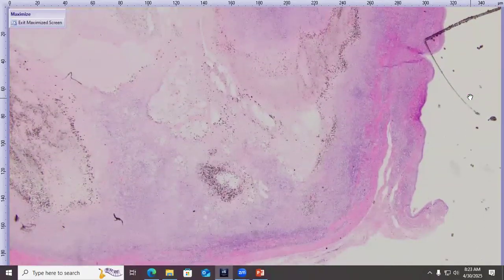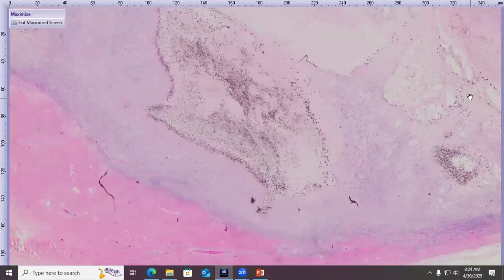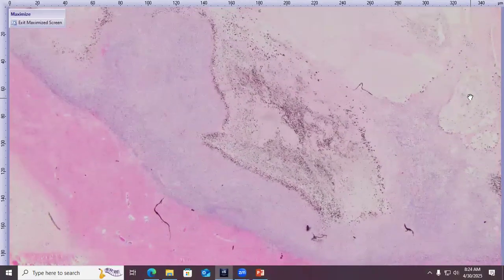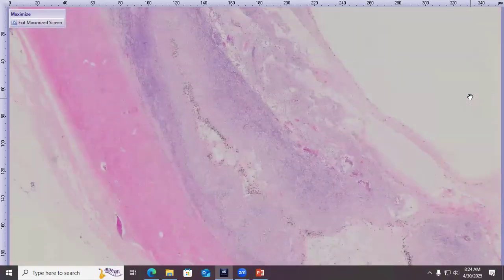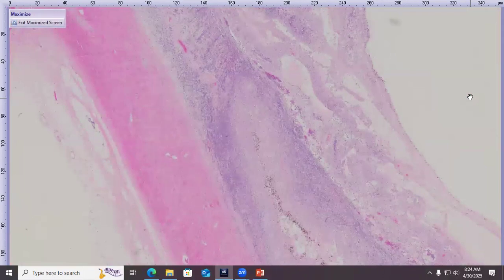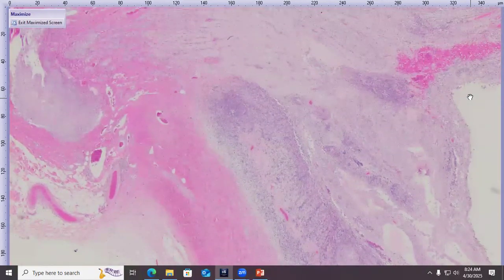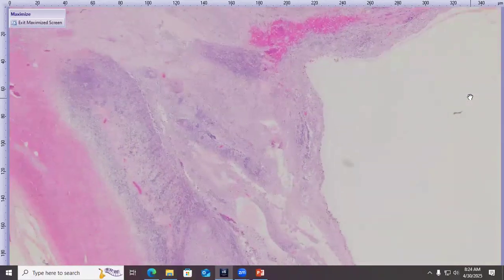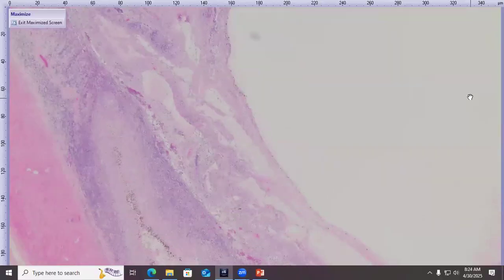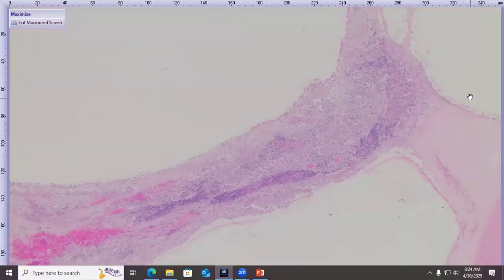It's totally wiped out by this extremely dense cellular infiltrate. There's lots of melanin scattered about, which is of great interest. This infiltrate is very much centered on the uvea and most severe there, but it does involve a lot of surrounding structures. So it extends slightly into the sclera, and it does involve the retina, which is back here, all detached and weird looking, and hardly recognizable as itself.